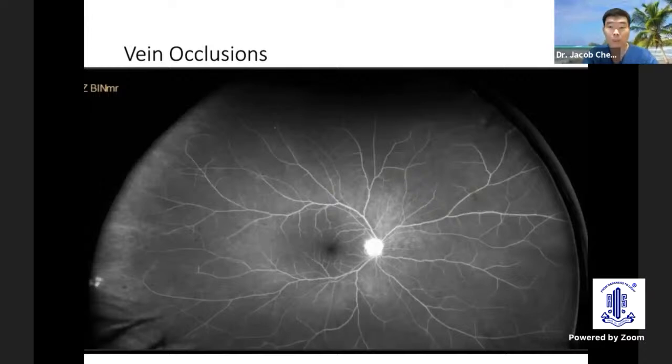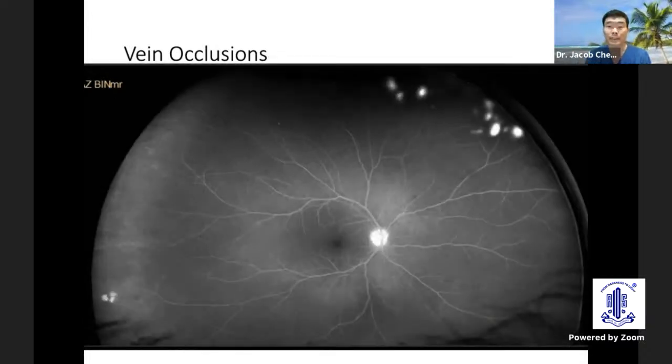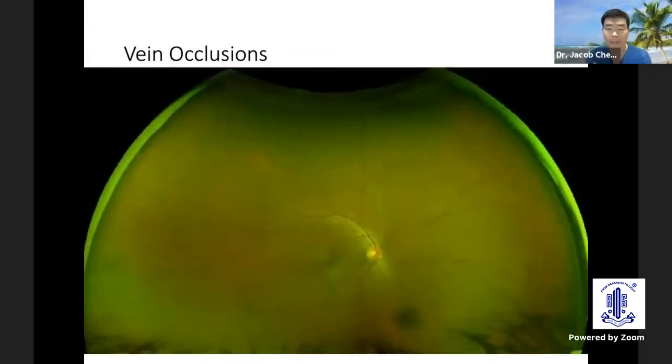Interesting in this patient, the opposite eye routinely, with the help of ultra-wide field, looks like a normal fluorescein angiogram. But you see these light bulbs on the superior part, which you would probably miss. I missed them on clinical examination. And this swings the diagnosis, needing further investigation of this patient's right eye.